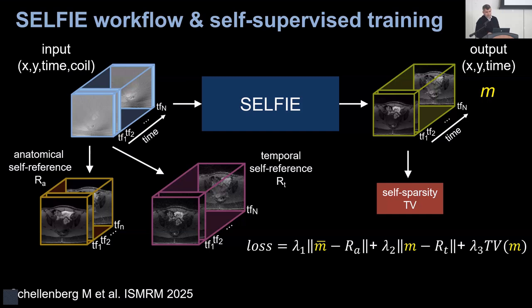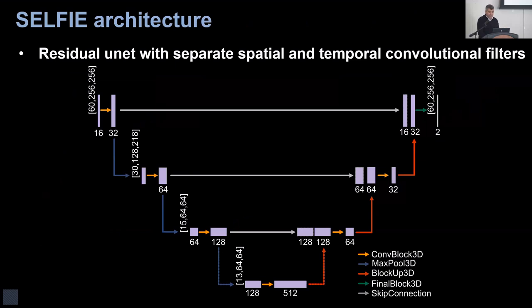We'll compare that to the anatomical reference, and then also to the temporal reference, and we'll apply the temporal TV on the output during training. Okay.